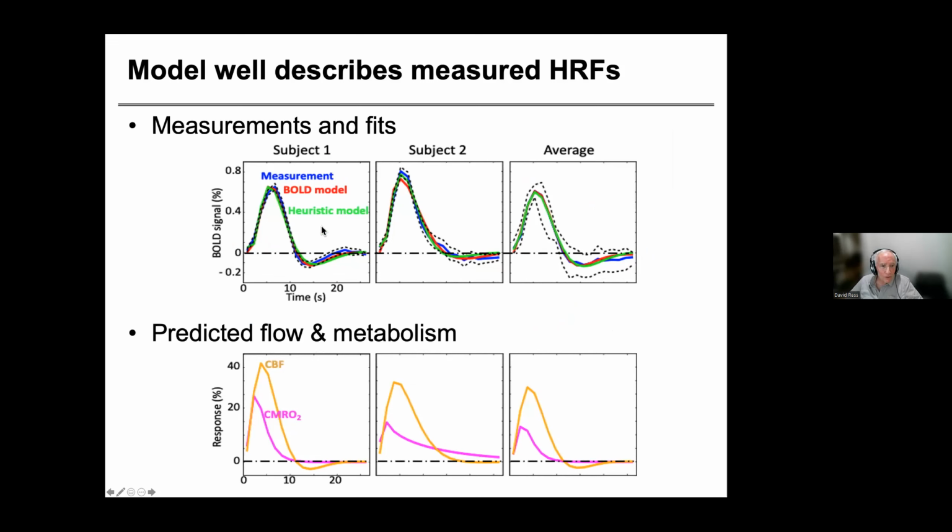So we have developed a technique called the SAST, the Speeded Audiovisual Sequence Following Task, to essentially light up the whole brain with these hemodynamic response functions. And the SAST is a very simple task. During a 2-second period of time, you're lying in the scanner, looking at the stimulus through a mirror behind the scanner bore on an LCD that's MRI compatible.